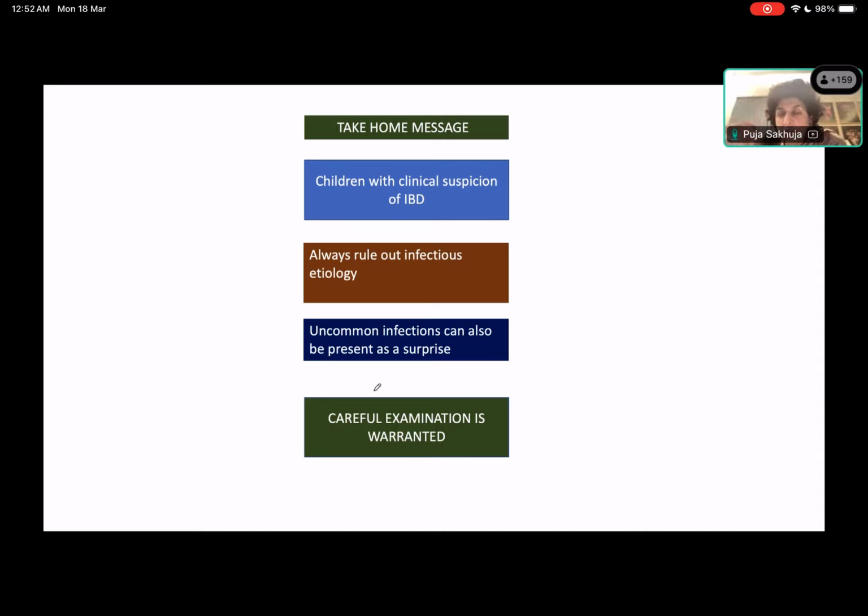And if not, and you are seeing the classical picture, of which the most important part would be basal lymphoplasmacytosis, then that is okay. If not, then be careful about just any mild chronic colitis. Do not give it a diagnosis of IBD, because then wherever the patient goes, he comes with a stamp, known case of IBD. So you have to be very careful about that. We don't want to misdiagnose, but we don't want to overdiagnose. So describe the thing. Just today in our reporting, one of my residents gave me a diagnosis and then was giving me a description based on the diagnosis, which is not okay. You give a diagnosis based on the description. So first describe it, then see if it fits with the diagnosis we wanted. Then that is okay. If not, do not force the diagnosis upon the case.